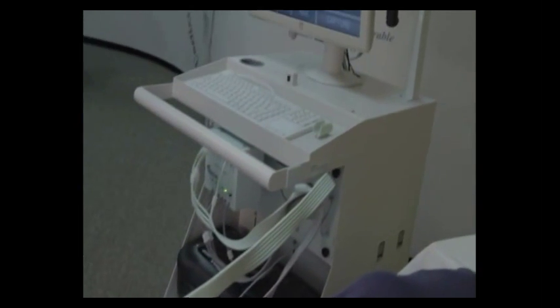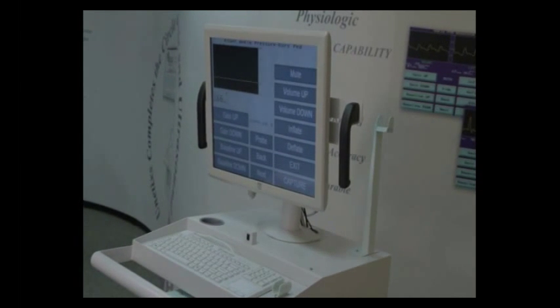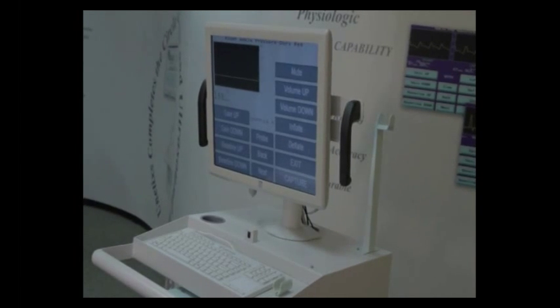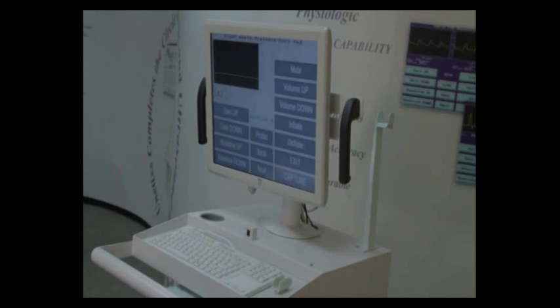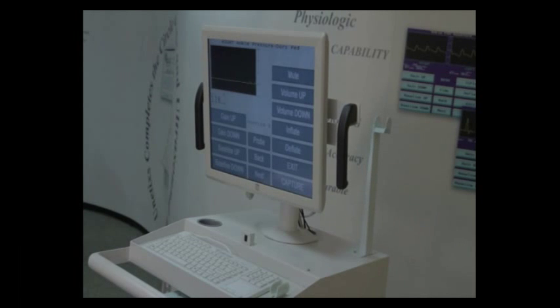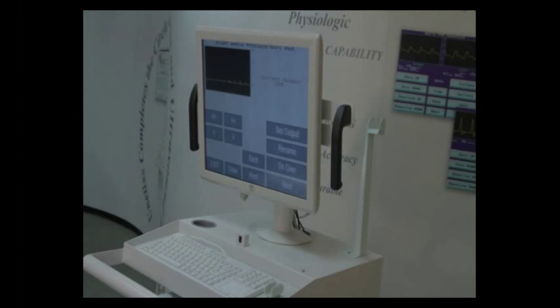Okay, you can hear that we've got a flat line, and you can see now from the screenshot that we have a flat line. We're going to press the deflate button on the remote control and wait until we hear that first reappearance of a pulse, pressing capture after we hear 3 or 4 beats. There's 4 right there, and we press capture.